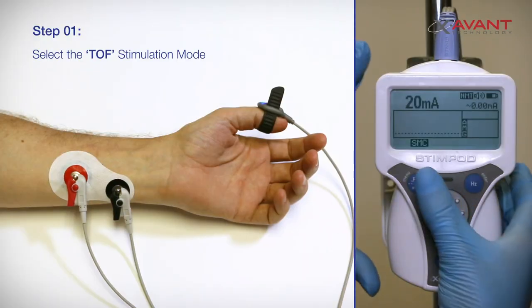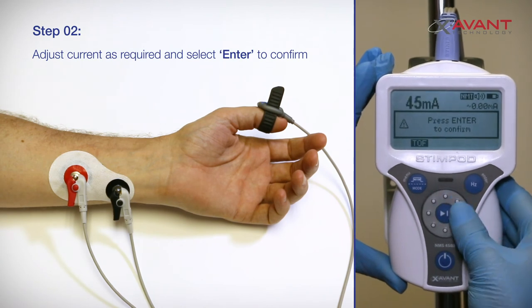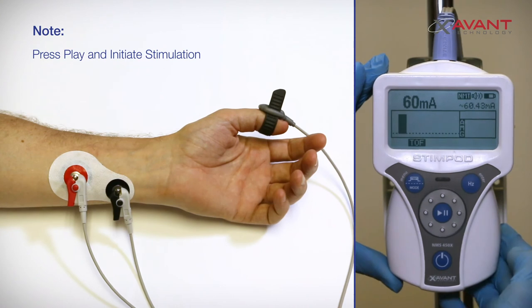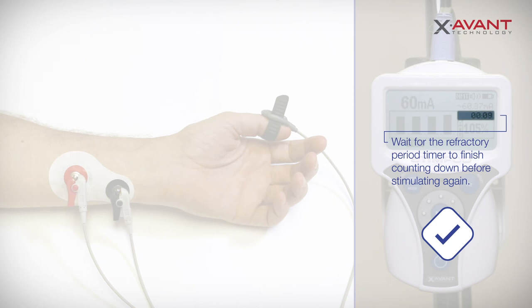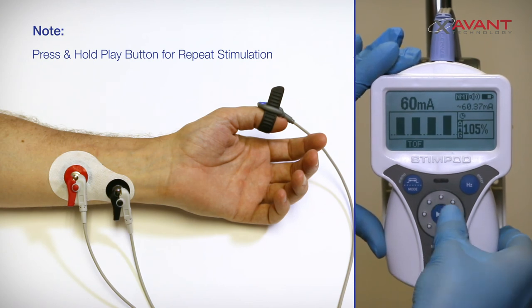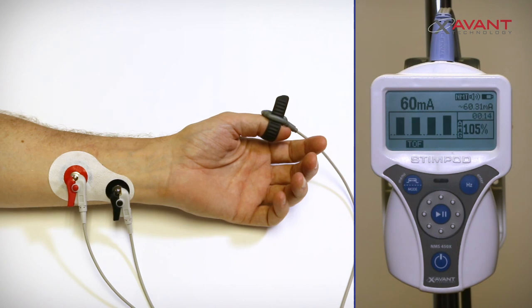Option B: Manual current setup. Use the mode button to select the TOF mode. Manually adjust the current using the adjustment wheel and press enter to confirm your choice. You can now continue to manually monitor your patient. Press the play button to initiate a single TOF sequence. Press and hold the play button for two seconds to initiate a repeat TOF stimulation while you continue to titrate the NMBA to achieve your TOF goal.